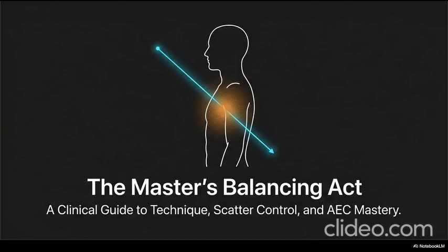Right. As radiation passes through the patient and hits the chamber, it ionizes the gas, creating a tiny electrical charge. Once that charge reaches a specific pre-calibrated threshold required to create a good picture, the circuit breaks and the AEC automatically terminates the X-ray beam. So it creates perfectly consistent image densities every single time, whether you are imaging a 100-pound patient or a 300-pound patient. It does. The machine just leaves the beam on until the chamber is full.